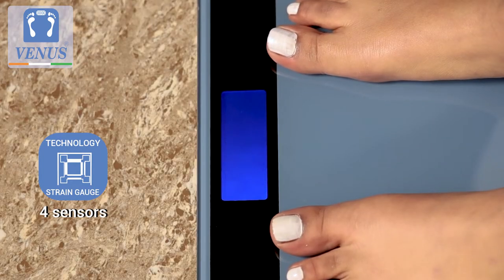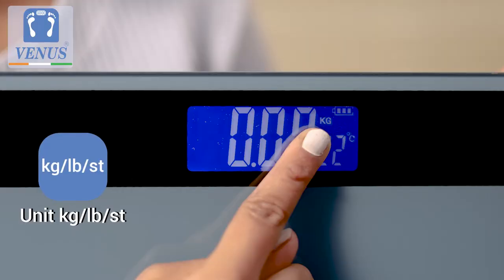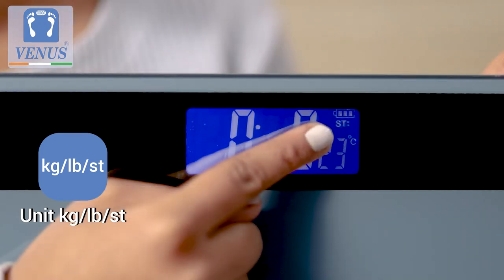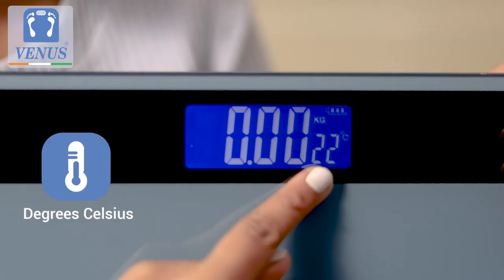Its four precision sensors showcase your weight on the large LCD display. The unit of measurement by default is set to kilograms and can also be adjusted to pounds or stones by simply pushing the button at the back of the scale. The scale also displays the room temperature in degrees Celsius.